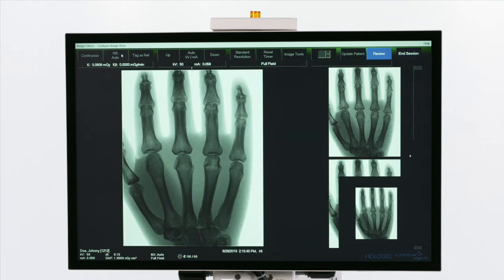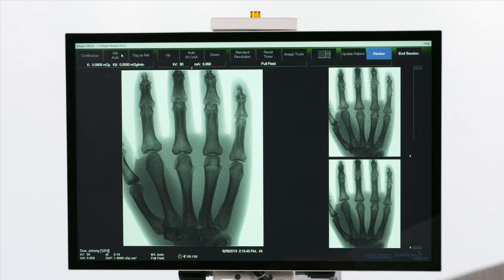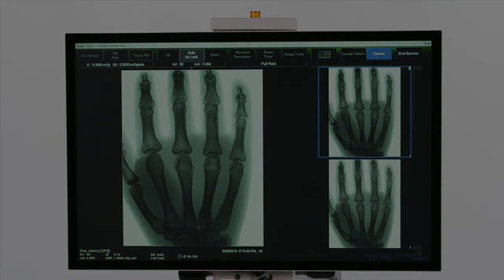To keep an image on the side of the screen, click the Tag as Reference button at the top of the screen. To change the dose rate, click the Dose button in the function buttons bar.